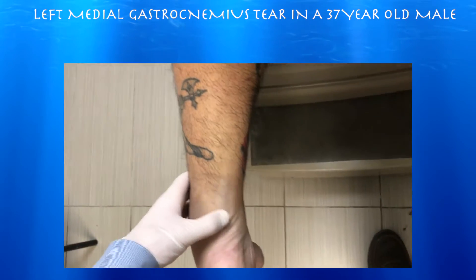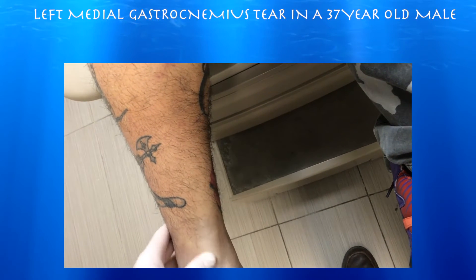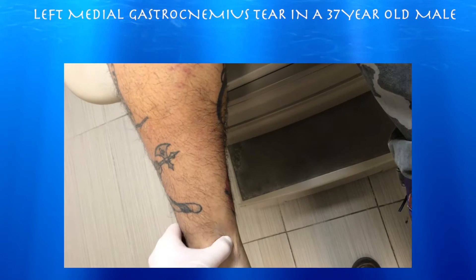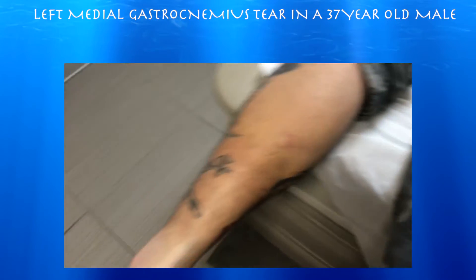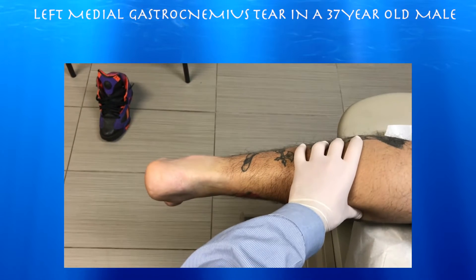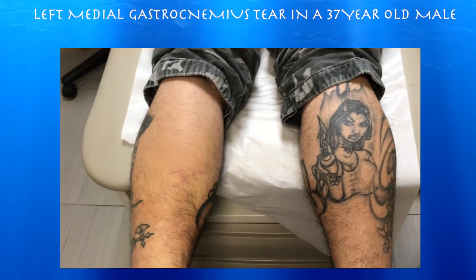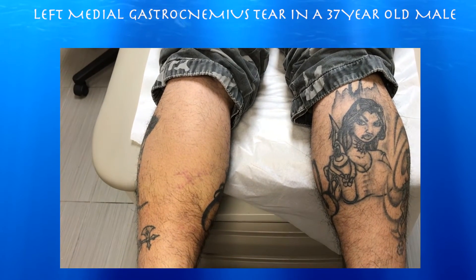Is there anything here in the Achilles? It hurts a little bit when walking, but not too bad. There's a normal-feeling Achilles tendon. I'm going to give a little squeeze here — and we've got a negative Thompson test. The two sides don't look too much different, other than the different tattoos.